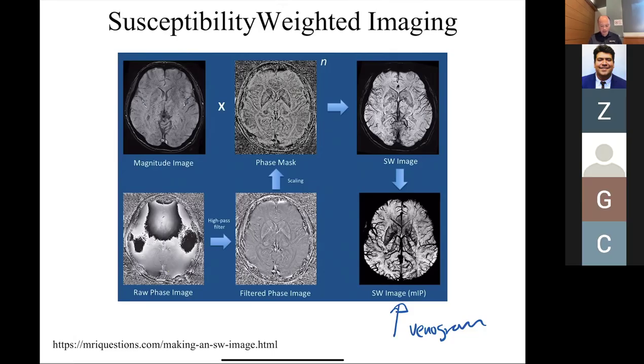Okay, so this is an example where something that was an artifact in the previous slide is now the source of information. Okay.